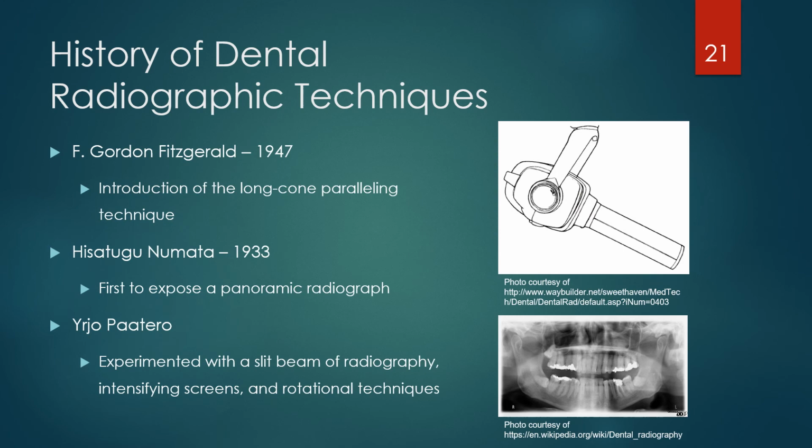Next, we have F. Gordon Fitzgerald, and he is nicknamed the father of modern dental radiography because of his work in the introduction of the long cone paralleling technique. Even though it was originally introduced much sooner by Edmund C. Kells in 1896, he refines it by using this long cone you can see in this top picture. And in doing so, he was able to give a much more diagnostic quality to his radiographs.